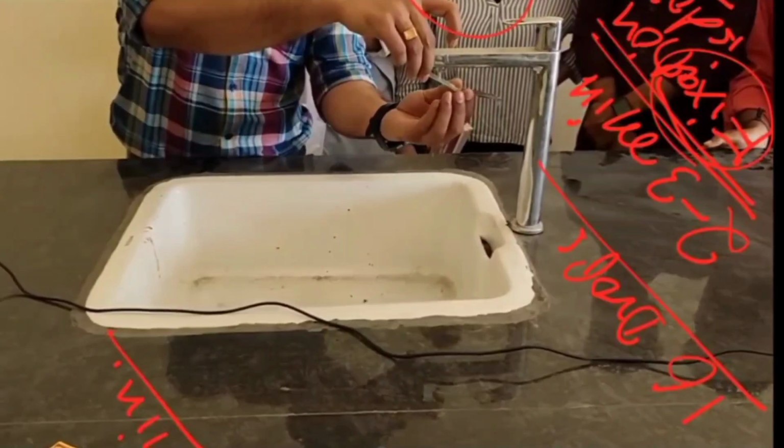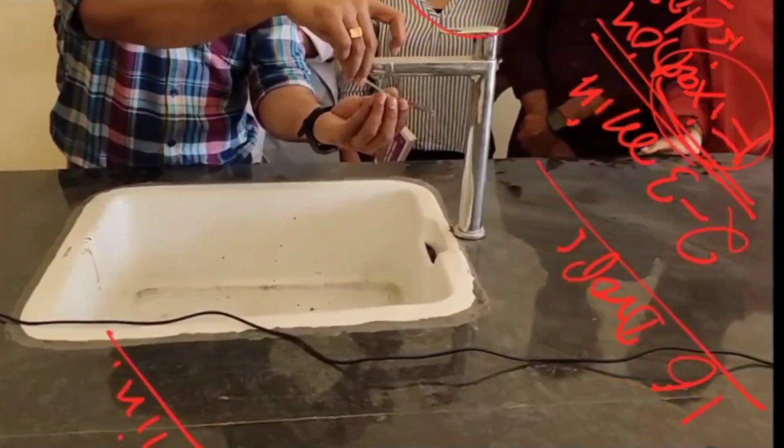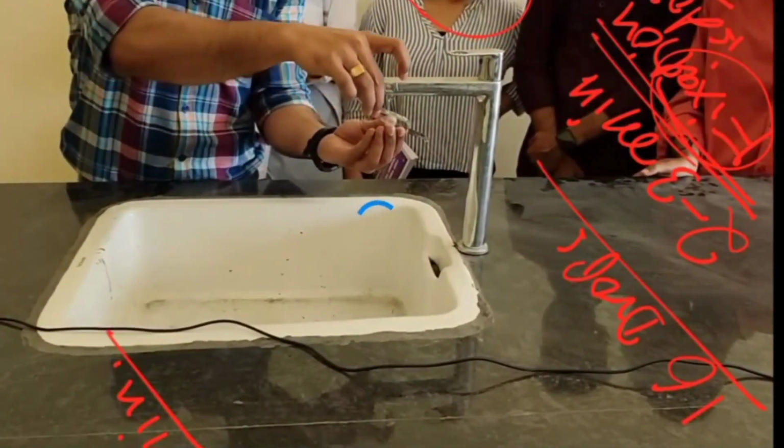Now I'm washing. How to wash it? You can put it directly under the tap, but be very careful. The tap should be open only slightly, allowing a small amount of fluid to come out, otherwise all your blood will come out with the force of the water.